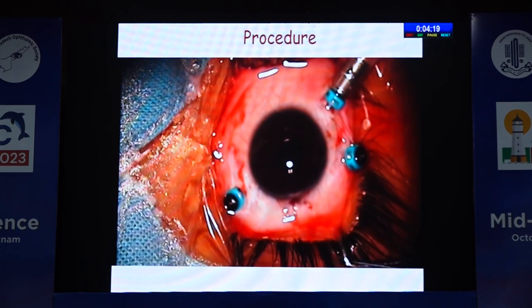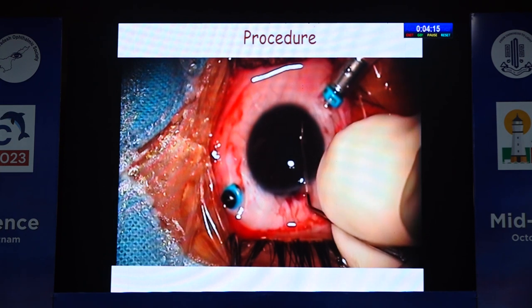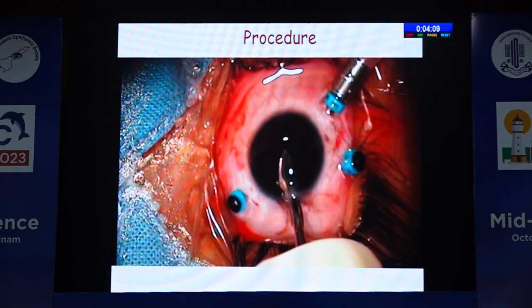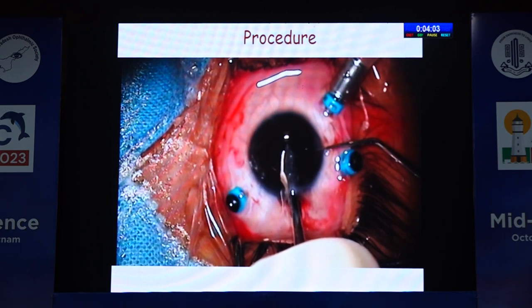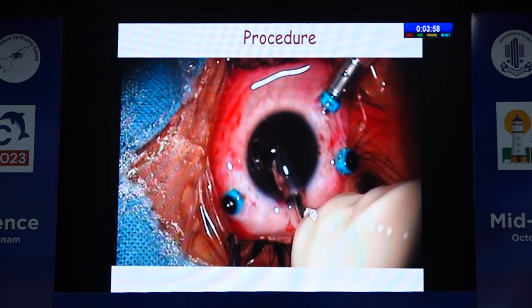I also prefer the corneal section to save the superior conjunctiva if needed for a future trabeculectomy. Once the IOL is placed, dial it into position in line with the side ports. With the help of a reverse Sinskey hook or rod, the iris tissue can be tucked into the claw. Note the direction of movement of the rod — it should be a vertical down-and-out movement, not a vertical up-and-down movement.